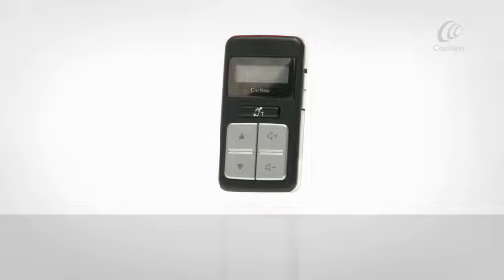Volume is the level of sound you hear. Sensitivity is the range of sounds you hear, for example, soft, background, close or far away. You can select from up to 10 volume levels or 21 sensitivity levels.